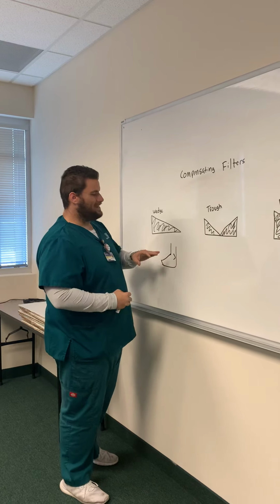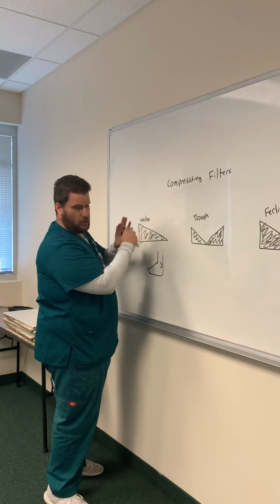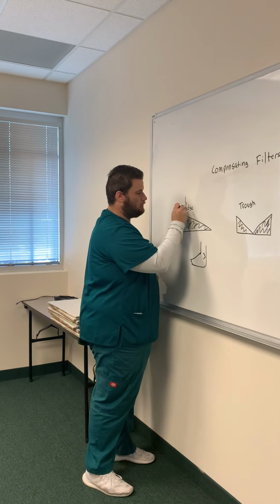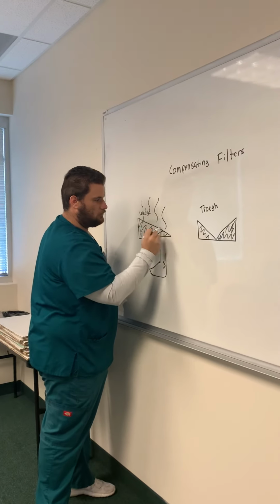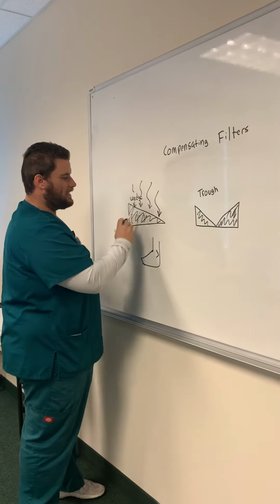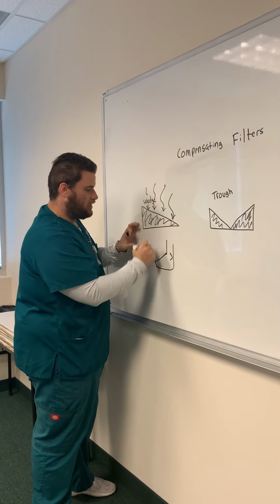You would put the thicker part of the foot towards the thinnest part of the filter, so that when the X-ray photons come down, they get more absorbed on the thicker part of the wedge.